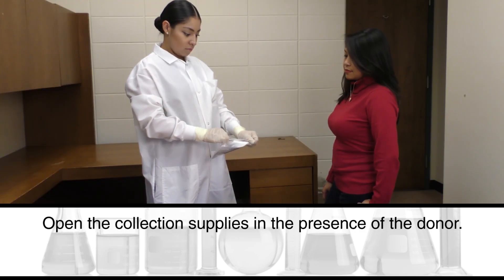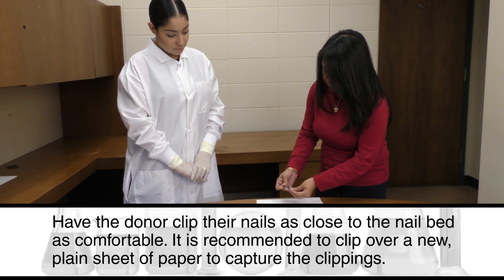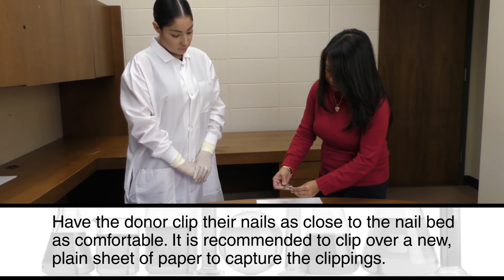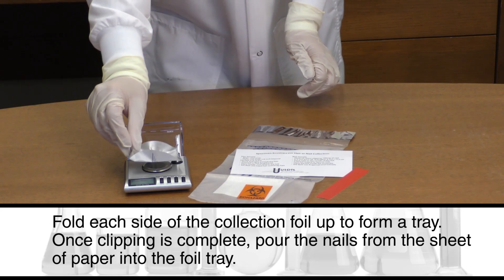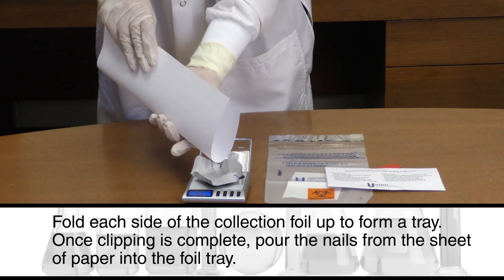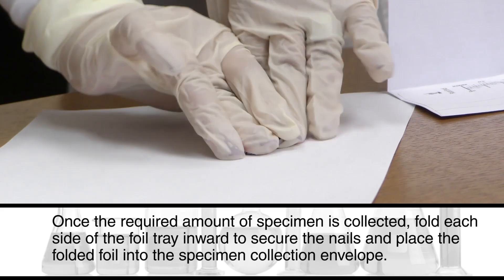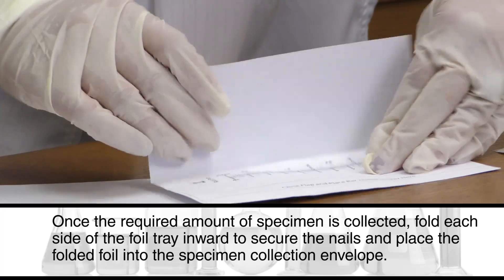Open the collection supplies in the presence of the donor. Have the donor clip their nails as close to the nail bed as comfortable. It is recommended to clip over a new, plain sheet of paper to capture the clippings. Fold each side of the collection foil up to form a tray. Once clipping is complete, pour the nails from the sheet of paper into the foil tray. Once the required amount of specimen is collected, fold each side of the foil tray inward to secure the nails and place the folded foil into the specimen collection envelope.